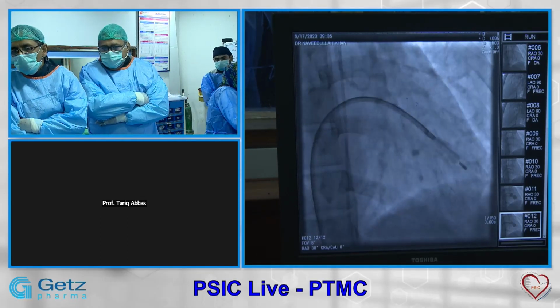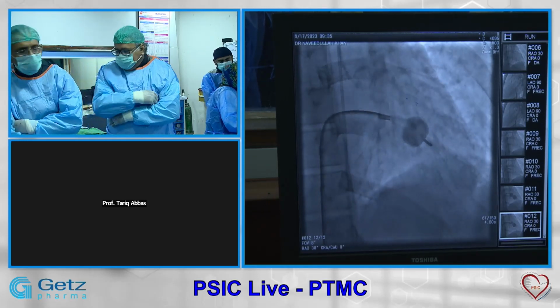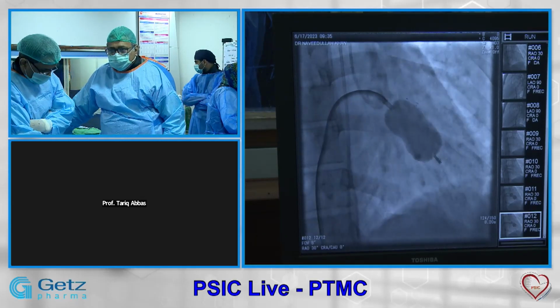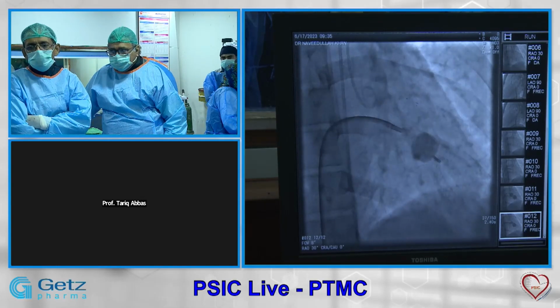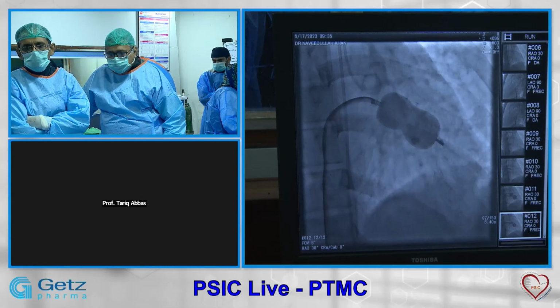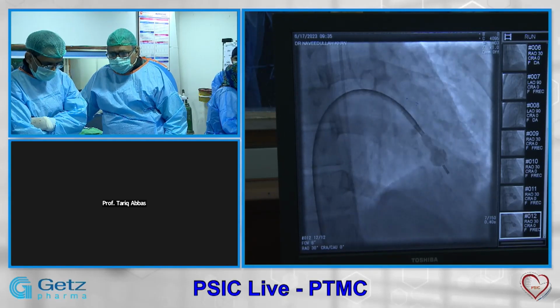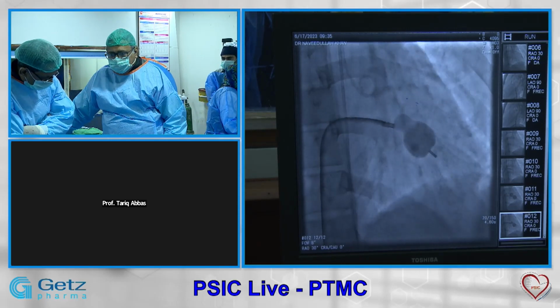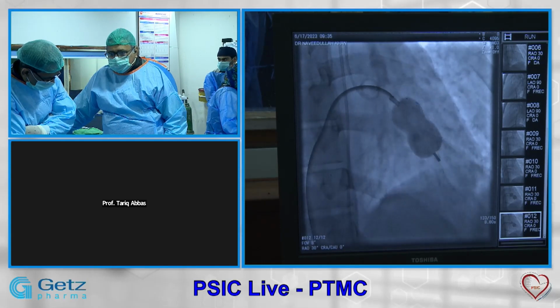He should avoid going fast because at any stage you can create a complication. People are not doing right heart catheterization now. When we were trained, we were doing right heart catheterization first, pre and post, to know what is happening on the right side, and the criteria for success should be defined and elaborated very well. Thank you very much.